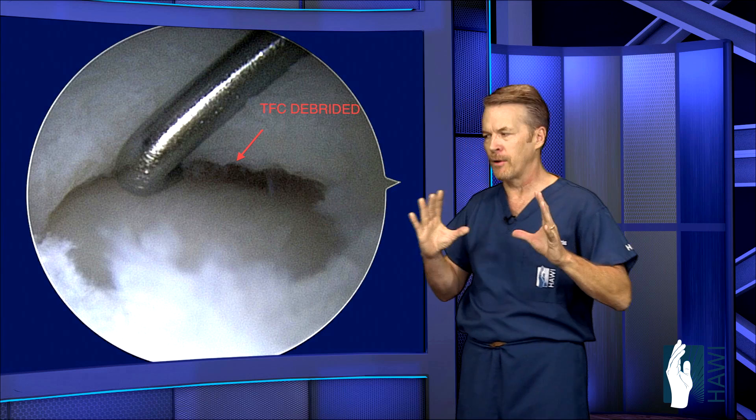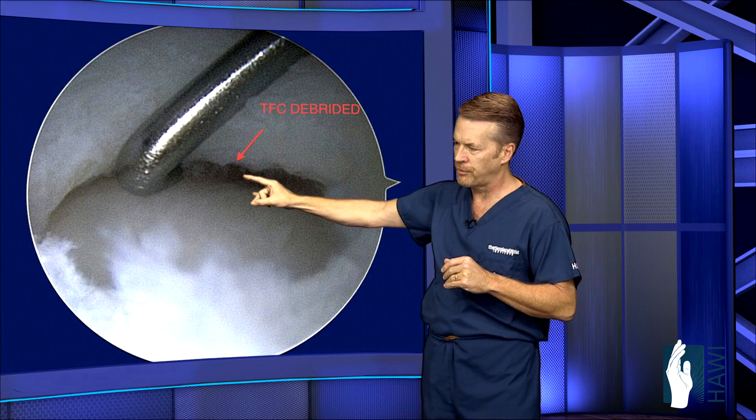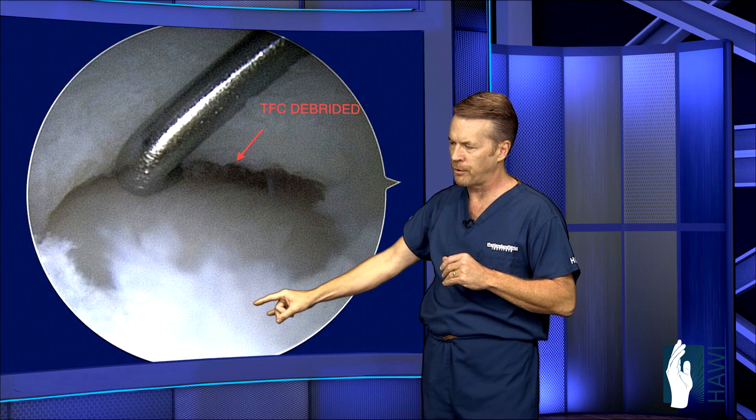Now let's take a look at a final image of this debridement. You can see the probe coming in here — this shows the TFC that's been debrided or trimmed away. This shows a nice picture of the head of the ulna and the radius over here.